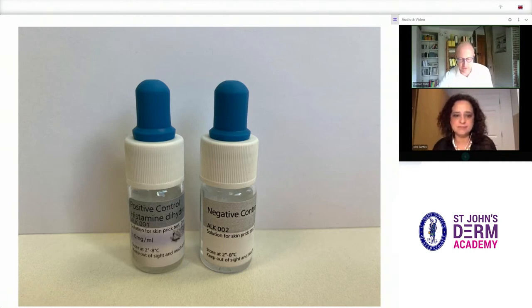These are the positive and negative controls. The positive is histamine, which should induce a wheal in all patients, and the negative control is saline, which should not induce a wheal, unless you have dermatographism.